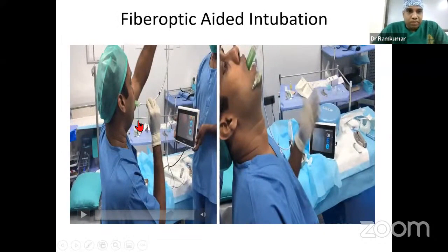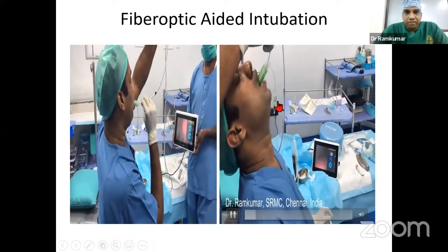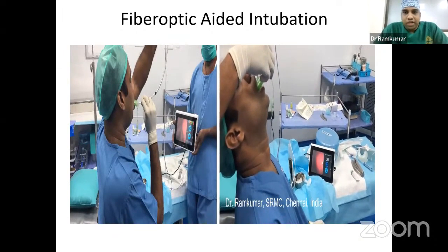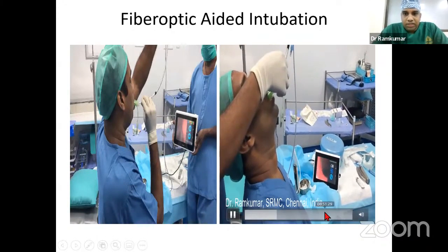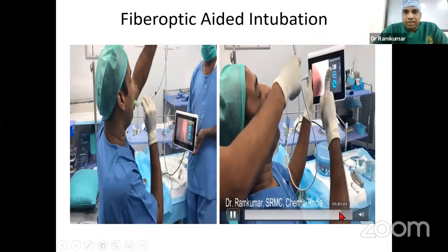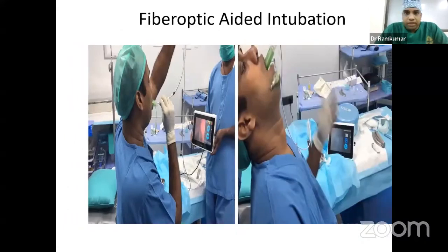Here I can do a single-step fiber optic intubation. The first thing is that I can visualize my own glottis. That means the placement is perfect. Another technique is where I'm trying to intubate. I had 4% xylocaine nebulization and placed the Ambu device into my hypopharynx, and my colleague is able to visualize the glottis, then the carina. Finally, he is able to pass the tube. The tube is able to pass, and I could see my own carina. This is still possible in a difficult airway scenario where you don't want to anesthetize and get into trouble.